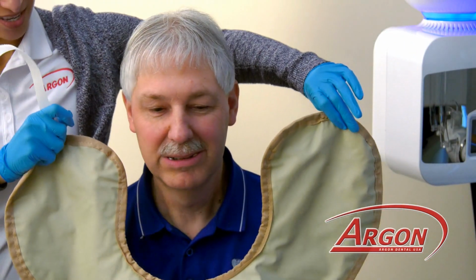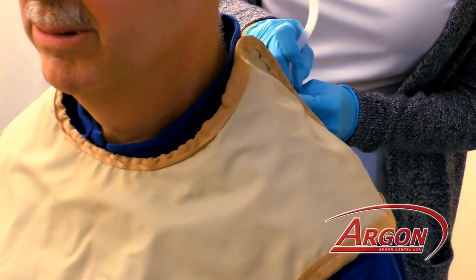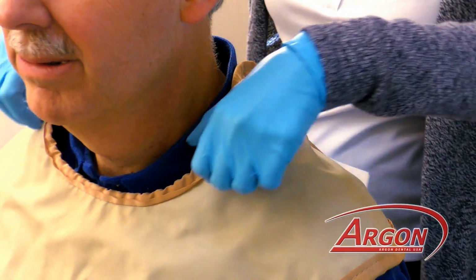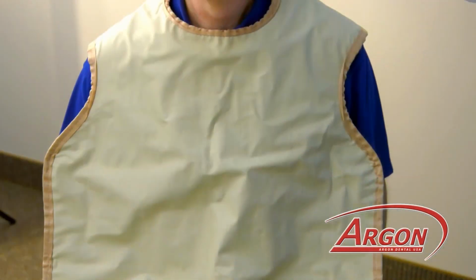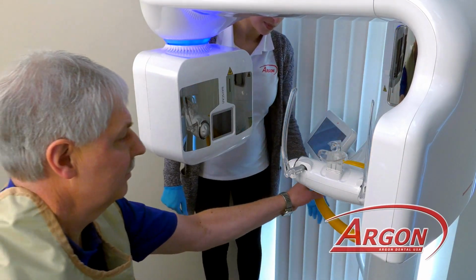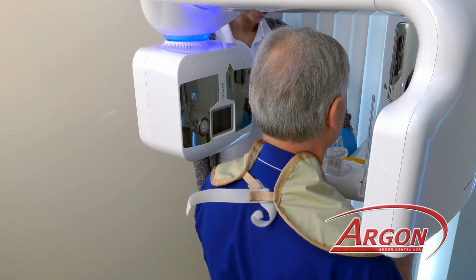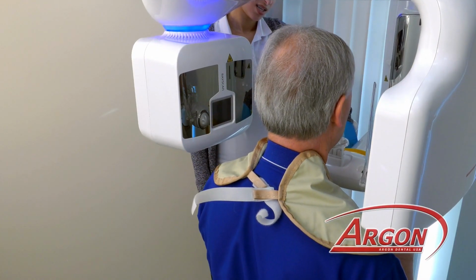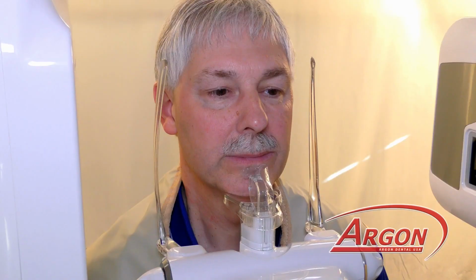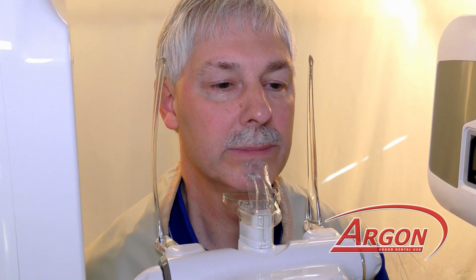We recommend installing a lead apron just for patient protection. This CT scanner allows for both a sitting position and a standing position. We recommend a sitting position as this holds the patient in a more stable position, which minimizes patient movement.